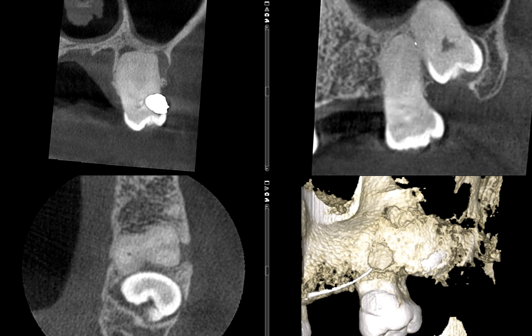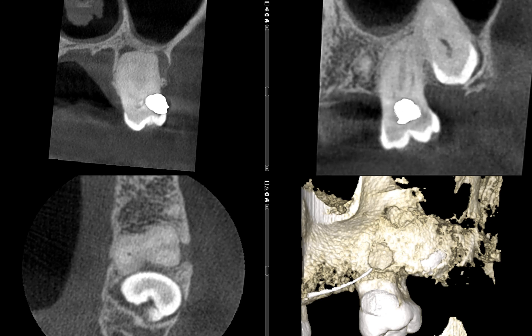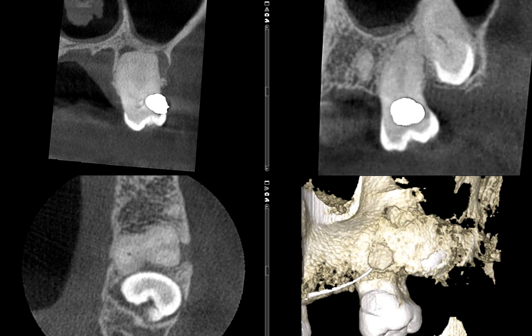Right here we can see that PDL space very well, whereas along the outline of the original root we no longer see a clear PDL space. So there it is — it's hard to see here, but we can see part of the PDL space in here as well.